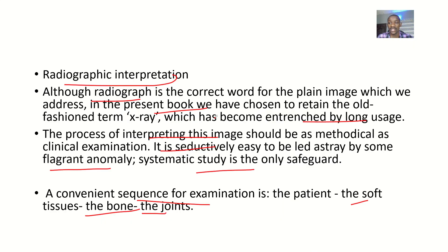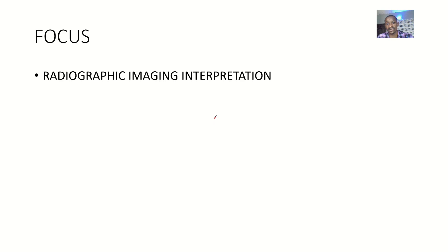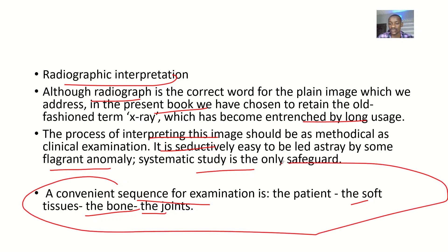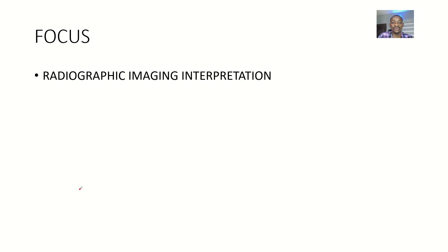A better title for this video would be 'The Sequence of Steps in Radiographic Imaging Interpretation,' because that is the most important thing in this lecture: look at the patient first, make sure that's the correct patient, then observe the soft tissues, then the bones, then the joints. That is the sequence in radiographic imaging interpretation.